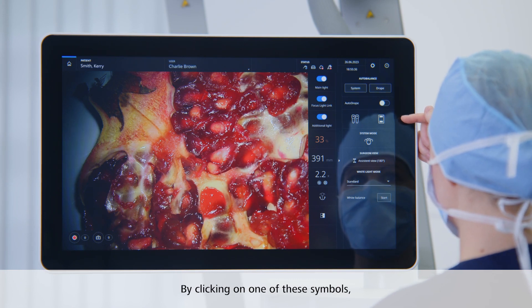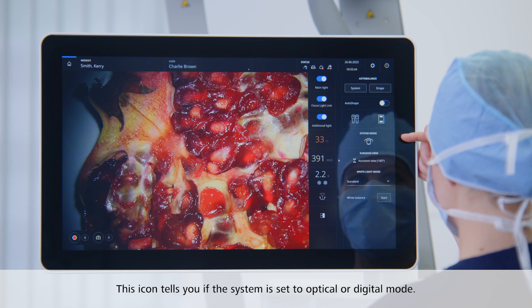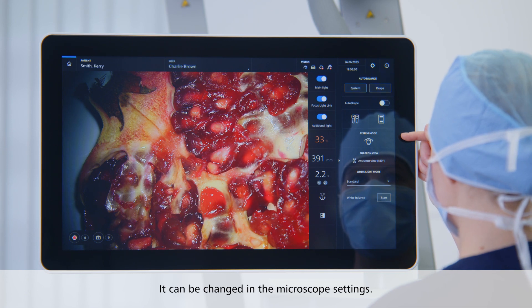By clicking on one of these two symbols, you can directly jump to the control settings for your hand grips and foot control panel. This icon will tell you if you have set the system to optical or digital mode. The mode can be changed in the microscope settings.